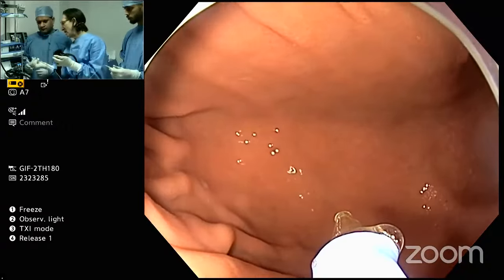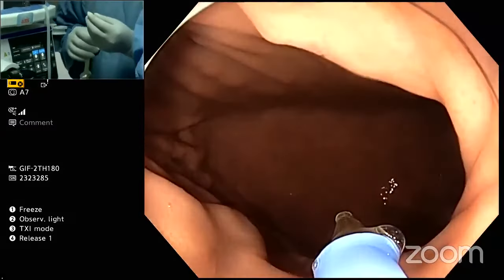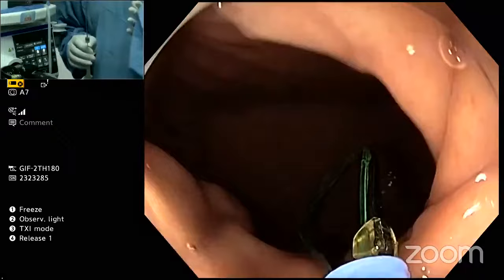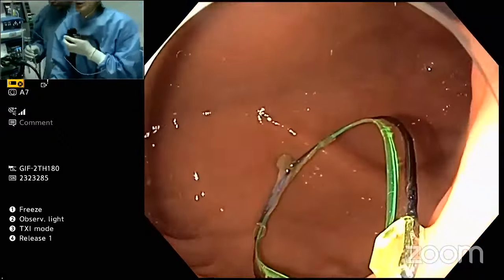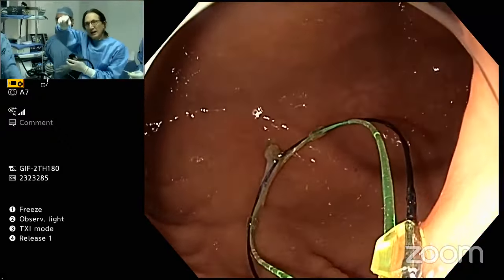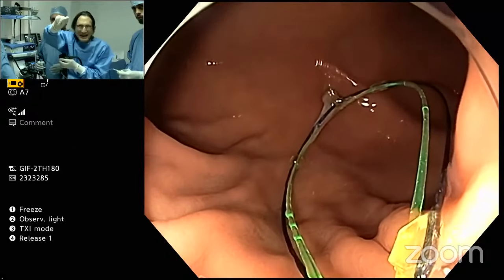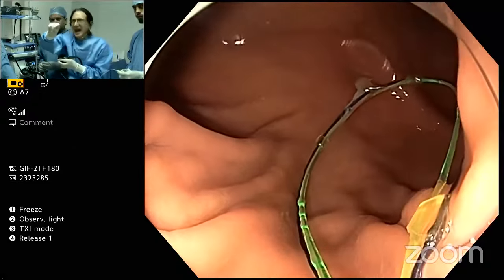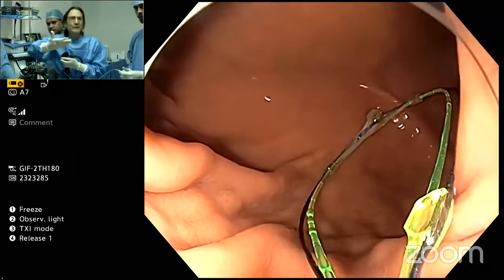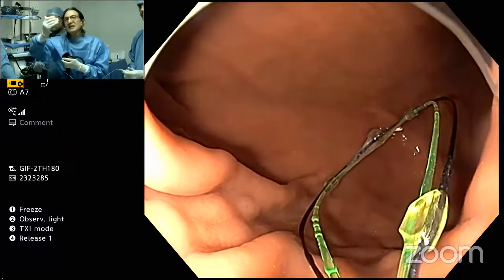So Ashwani, why don't you just show how you can open up in the stomach just to demonstrate for you. So go ahead and open up. So here you can see nicely how this loop is mounted on the snare, right? It looks like they're tied together. They are. There are little lugs there. It's a snap-on. And it is attached to the snare. So the snare is a scaffold that holds the loop nice and open. So it gives it the stiffness.